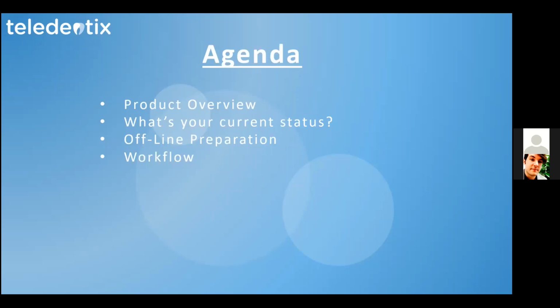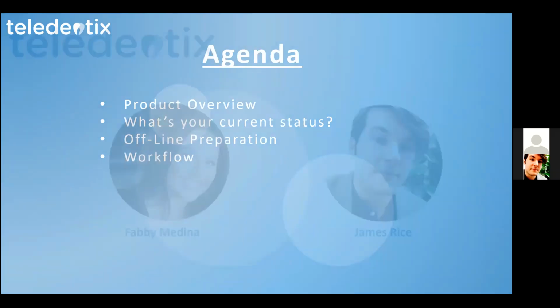So yes, we're also going to go over offline preparation. There are some steps, of course, that you need to take before you go to your site in order for all of this to work. So we'll go ahead and walk through that. And then last but not least, we'll go through the workflow. When you're online and you're capturing images, what does that look like? What are the new enhancements? All that good stuff.